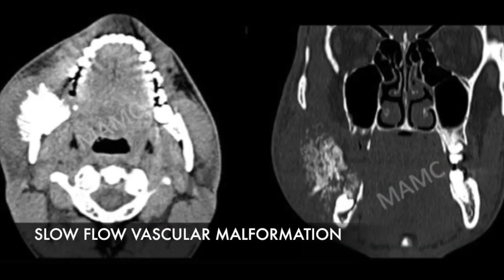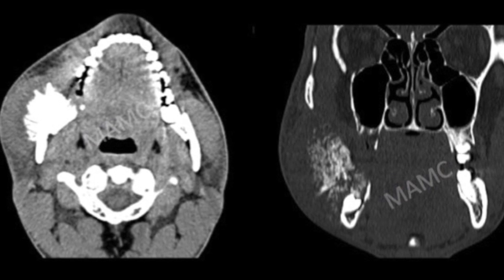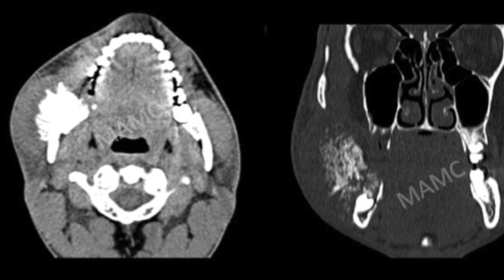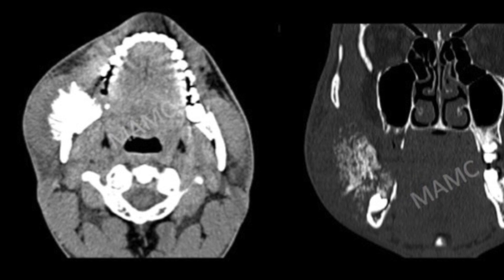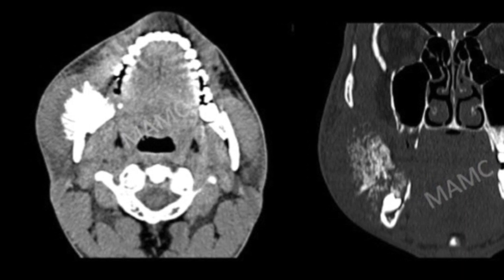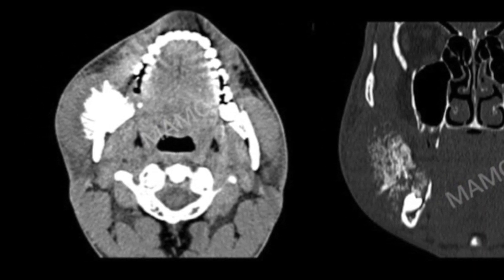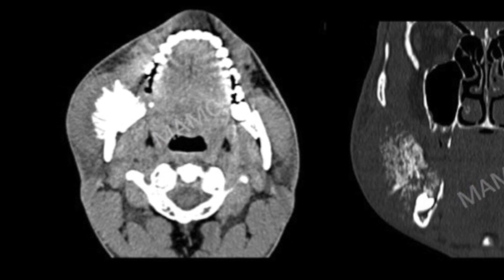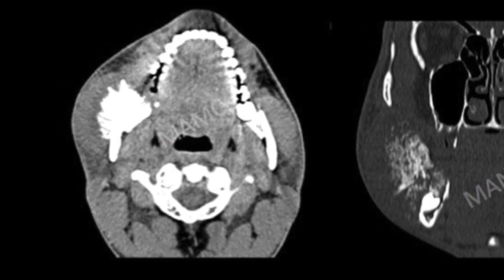Another patient, a 20-year-old, presented with a hard swelling on the right side. What we can see here is a lytic lesion involving the right mandible with osteoid matrix formation in the overlying soft tissues — a case of osteosarcoma.